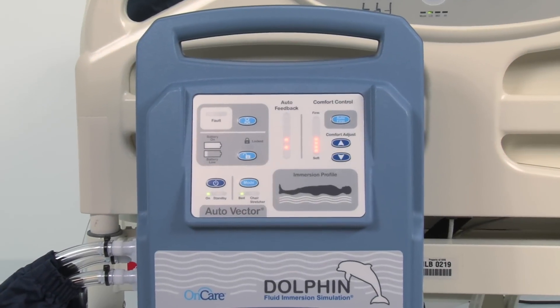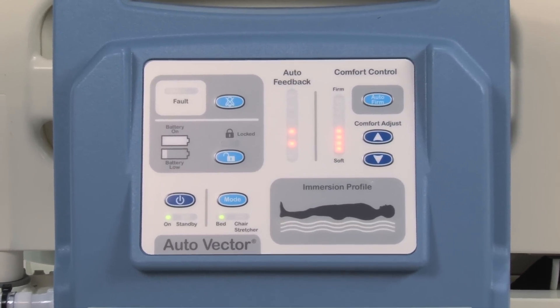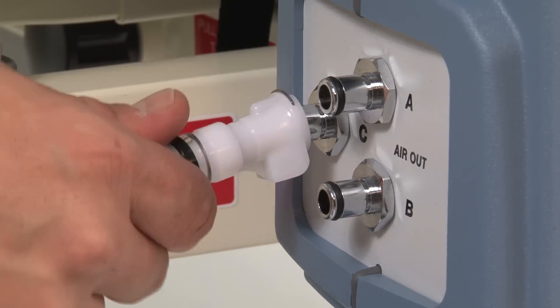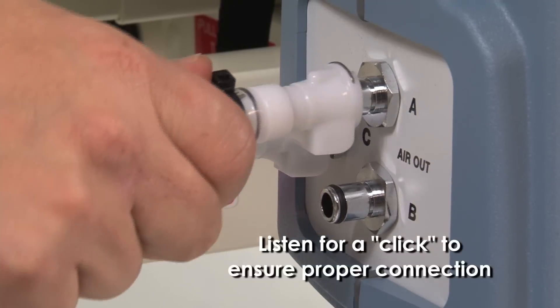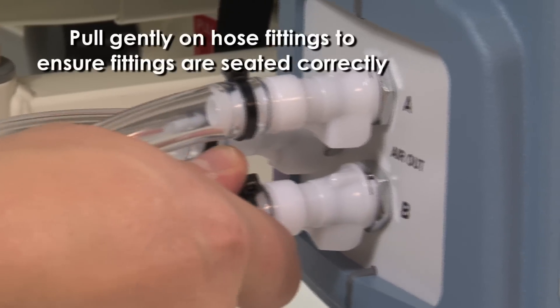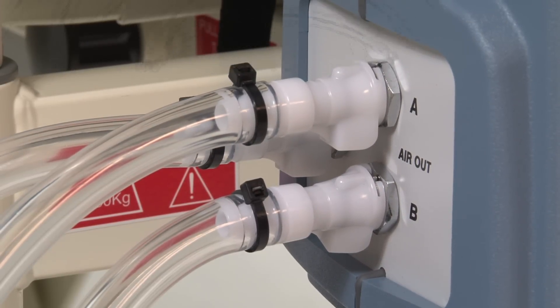The Dolphin features an easy-to-operate microprocessor-driven controller to provide advanced therapy. The controller connects to the mattress with three hoses, which may be attached in any order. It is important to listen for a click to ensure a proper connection. Pull gently on the hose fitting after connection to test if the fitting is seated properly — it should not release.